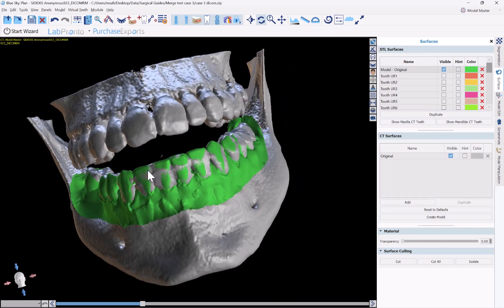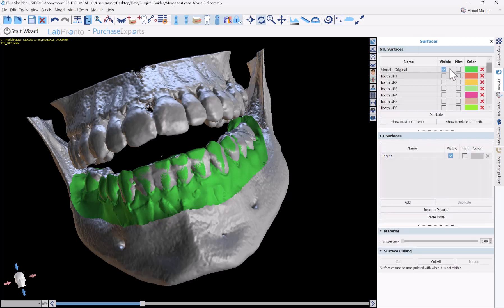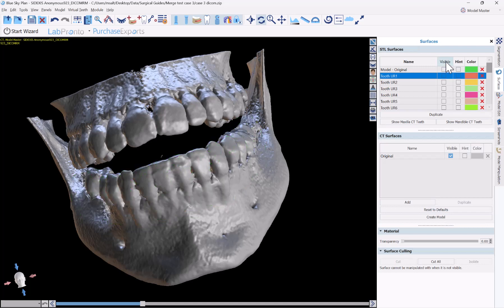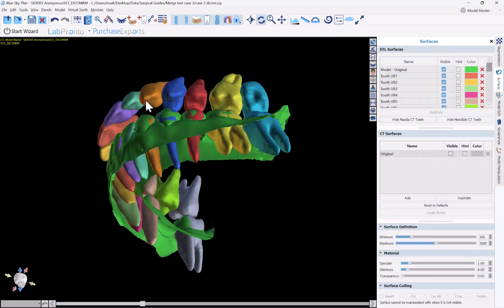I've imported the CT scan and aligned my intraoral scan model to the CT scan. I went over to my segmentation panel, clicked automatic tooth segmentation, and clicked create STL surfaces for all teeth. It's a single click, and after it runs for around a minute or so, you will have each tooth segmented as an STL file.